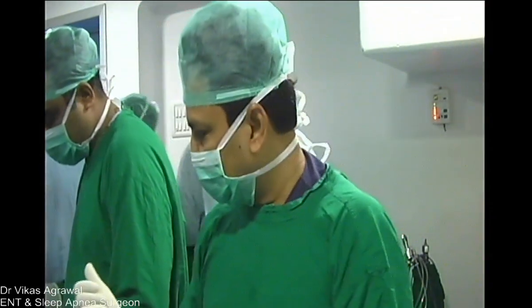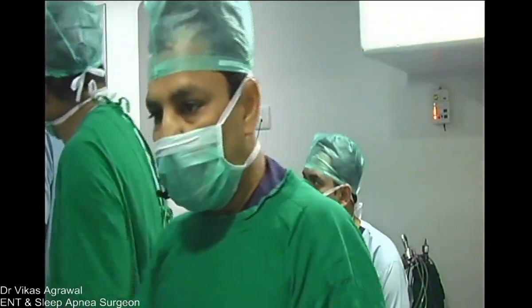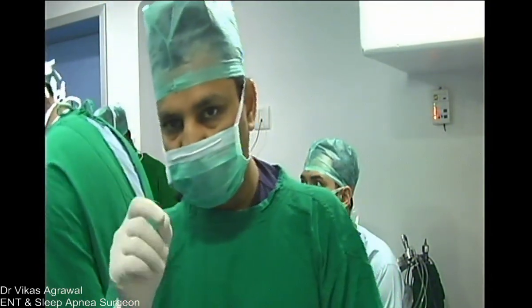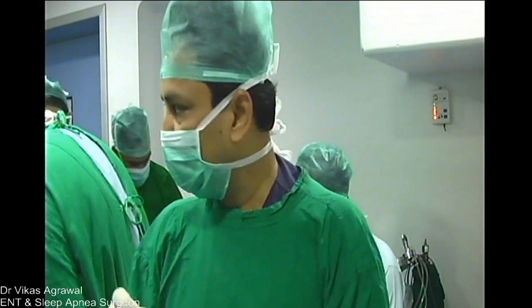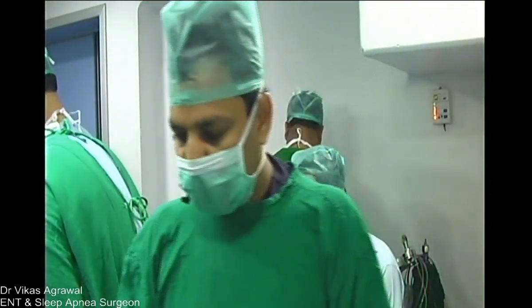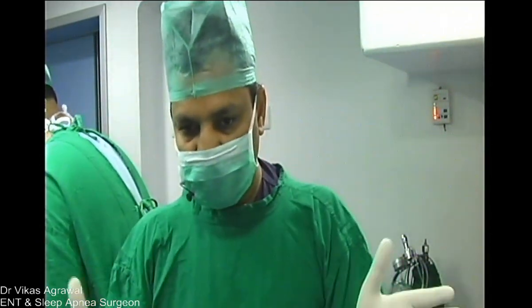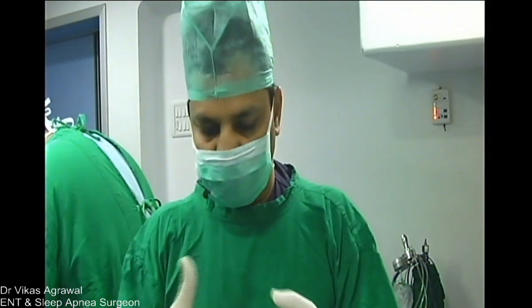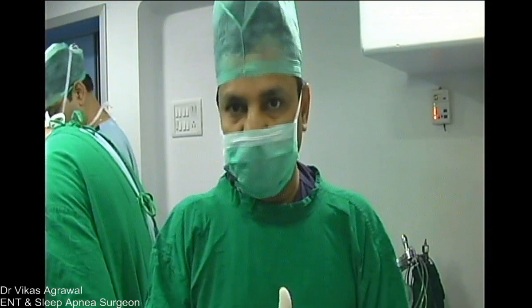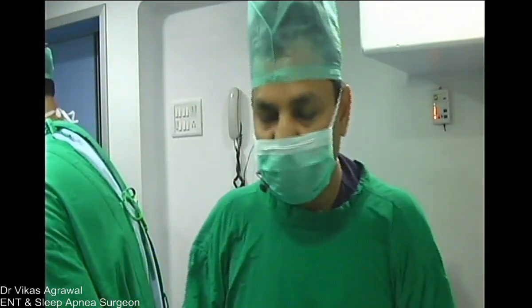So we are almost ready with the painting and draping. I'll be using a microscope so that you are able to see a very, very clear picture. I always use the microscope so that I'll be able to show you different fibers. You'll be able to see the paratonsillar vein, all the structures. And so once we remove the upper part of the tonsil and the palatopharyngeus along with the uvula, obviously for the AP collapse, then we'll be able to tackle both the AP and the lateral collapse or even the circular collapse in almost all the patients.